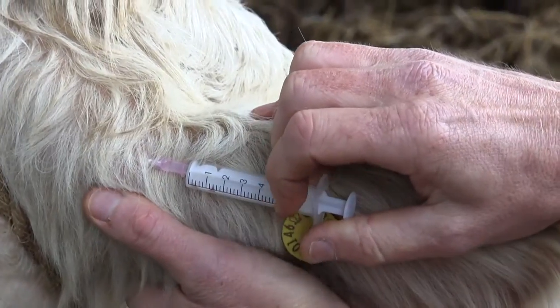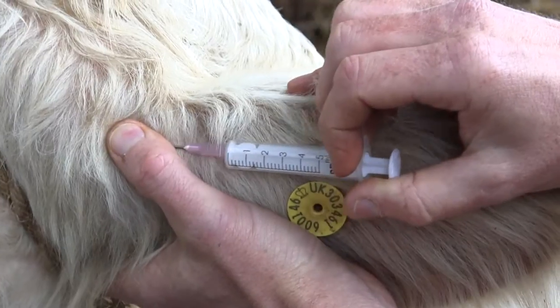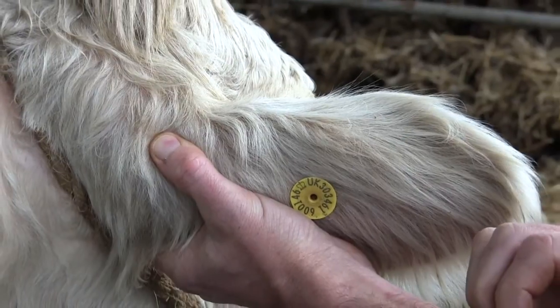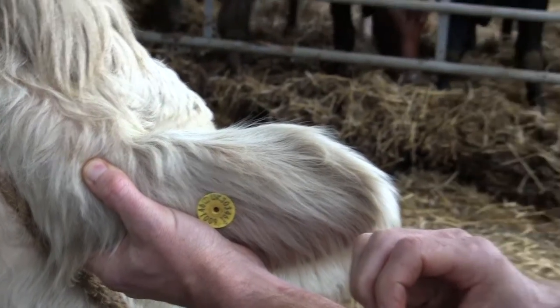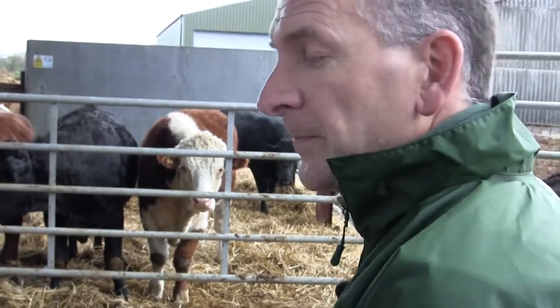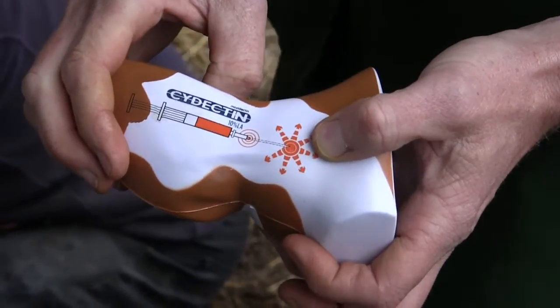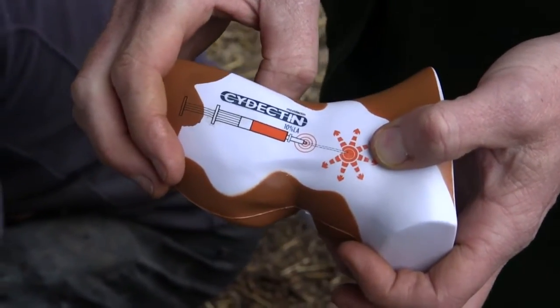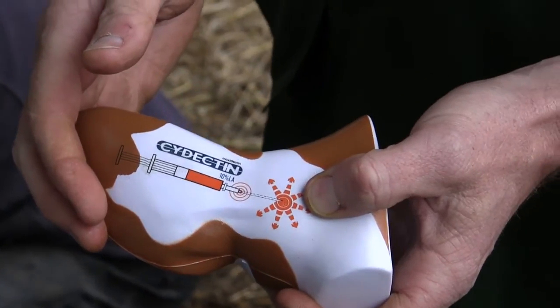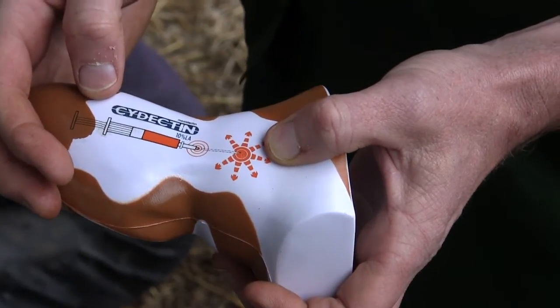Once the solution has been injected, the needle and syringe can be removed. As you do this, apply pressure to the injection site to ensure there's no leakage of product. The site where you need to deposit the product is shown on this model — you can see where the product should be deposited in relation to the base of the ear.